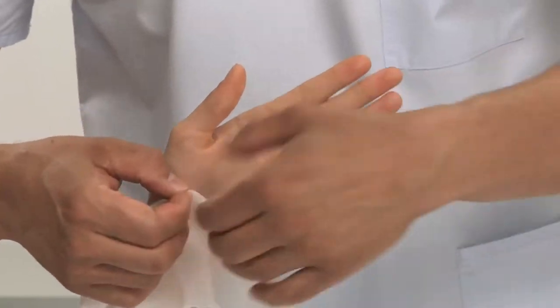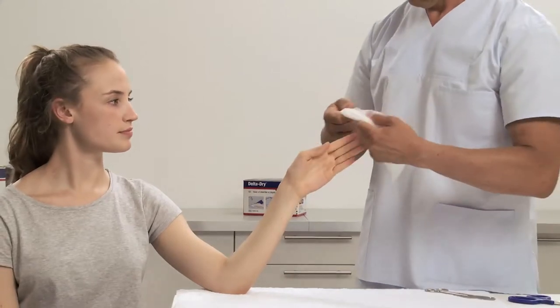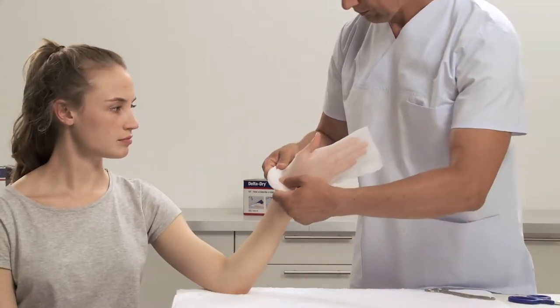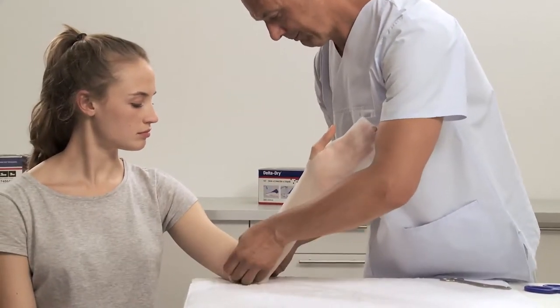Measure where to place the thumb hole and make a little cut with scissors. Roll up the stockinette before applying it on the limb to overcome sliding pressure during application. Roll off and remove all wrinkles and creases.